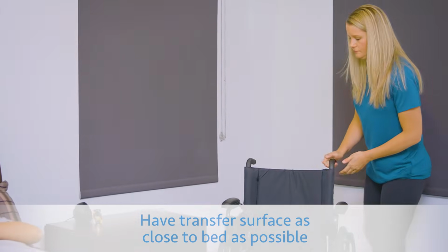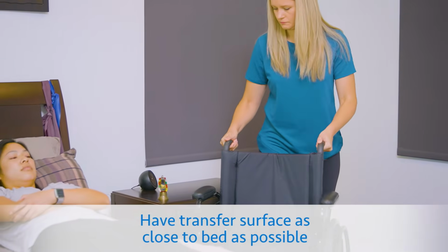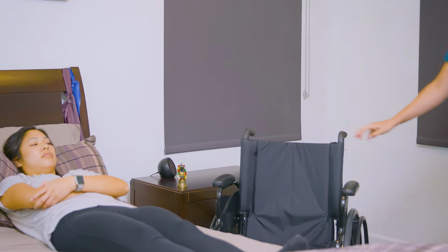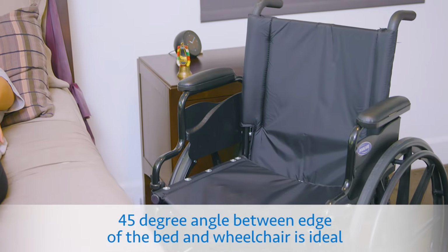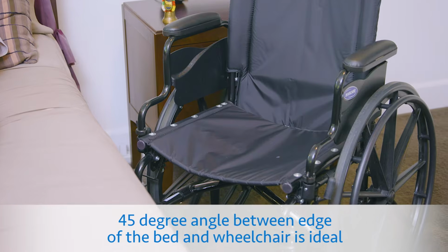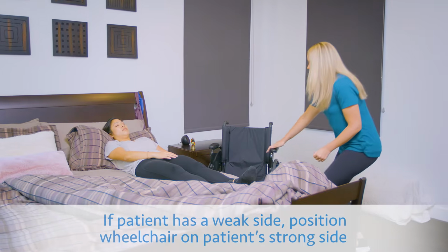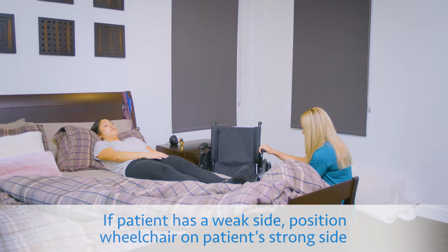It is important to have the transfer surface, in this case a wheelchair, as close to the bed as possible. This reduces the risk of falling because it is less distance to travel and takes less effort. A 45-degree angle between the edge of the bed and the wheelchair is ideal to minimize the distance traveled between surfaces. If the patient has a weak side, position the wheelchair on the patient's strong side.